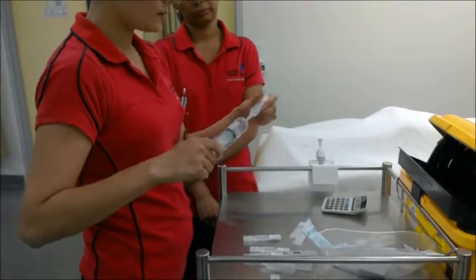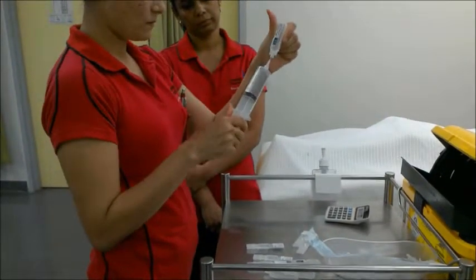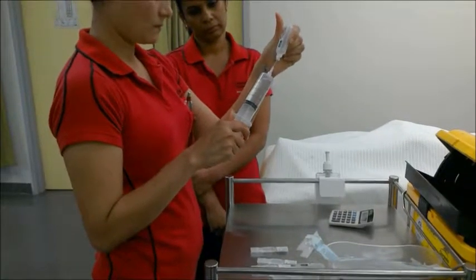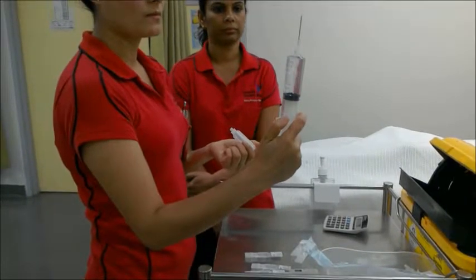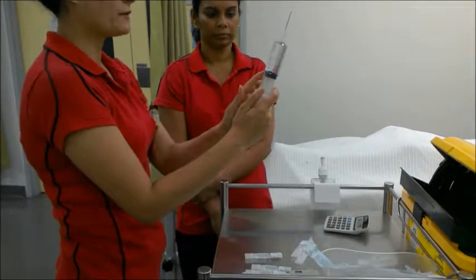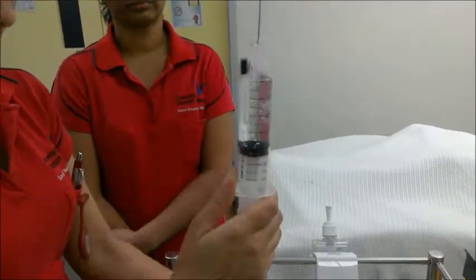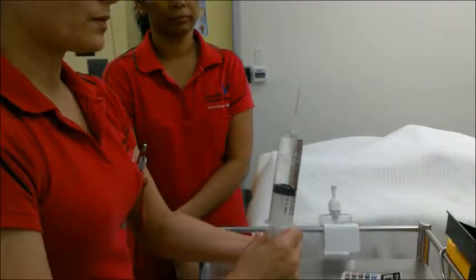Okay, so I have drawn up 40 mils of normal saline. I'm gonna draw up my morphine now.